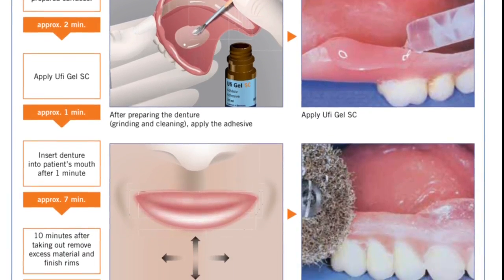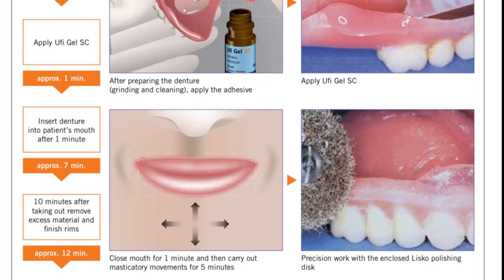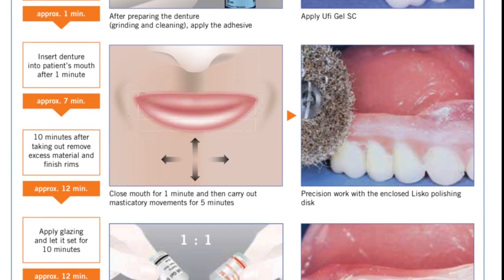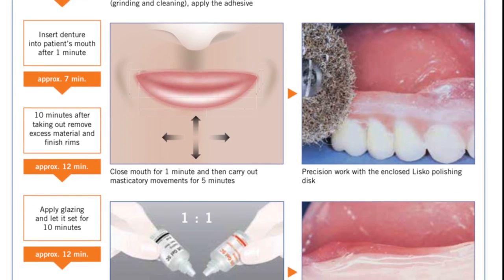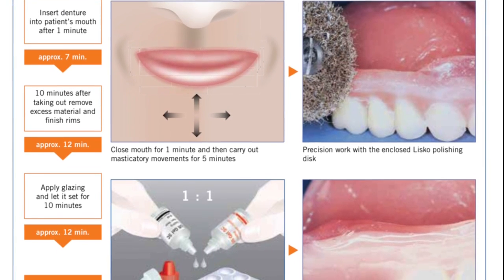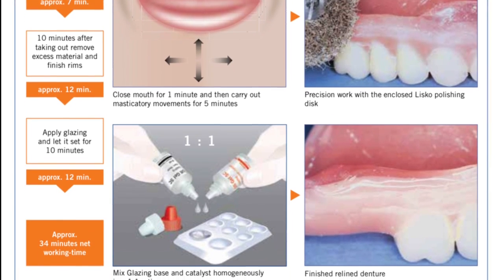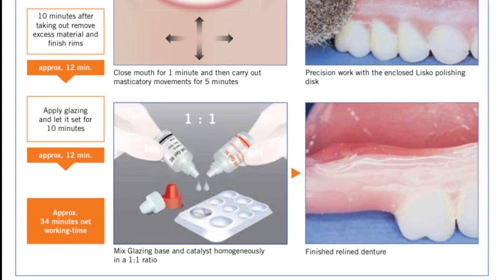I use VOCO Ufi Gel SC for my soft reline. It is an incredible product that's very biocompatible. It sticks to the printed resins if you follow the instructions. And we're going to go through this kind of slow here how you actually do these types of things with this particular material.